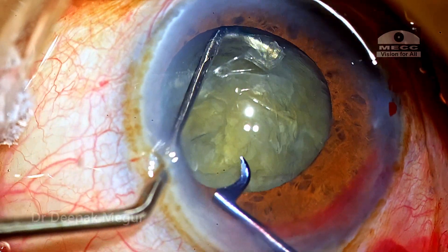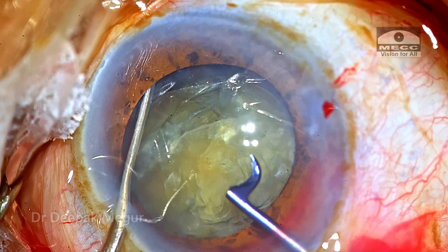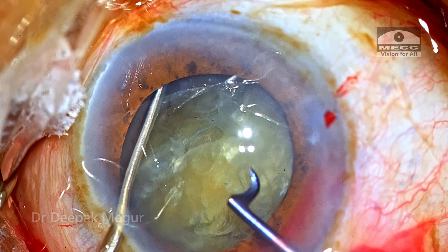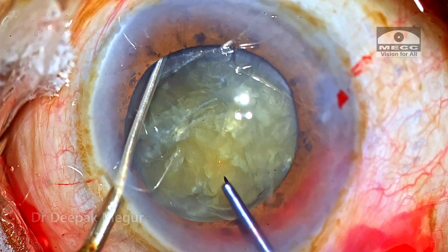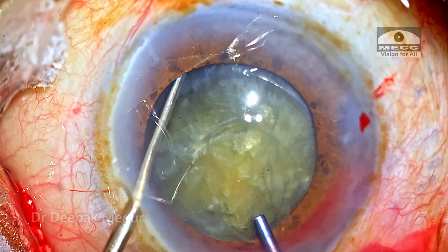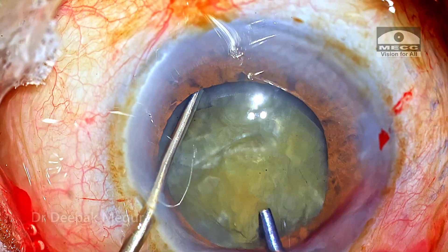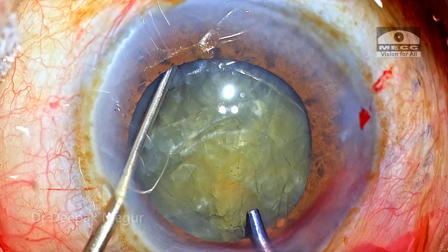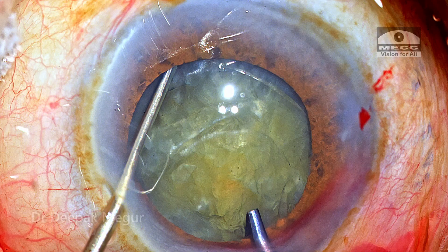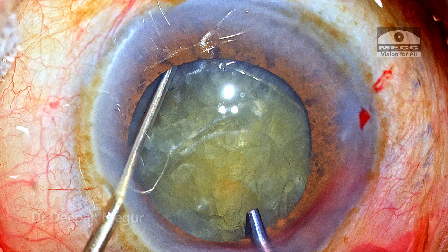The Chang chopper is turned horizontally as it slides under the distal rhexis margin and is then turned vertically to hook the endonucleus. Dr. Khan's pre-chopper is held just in the proximal part, that is just in front of the rhexis margin.